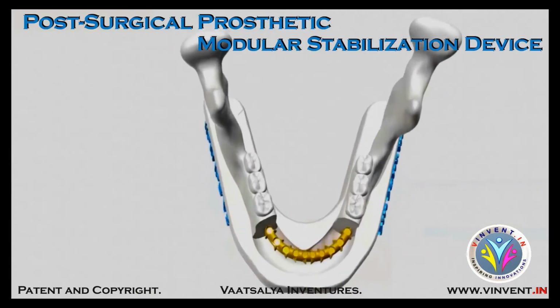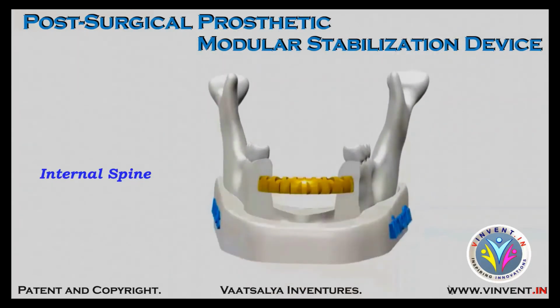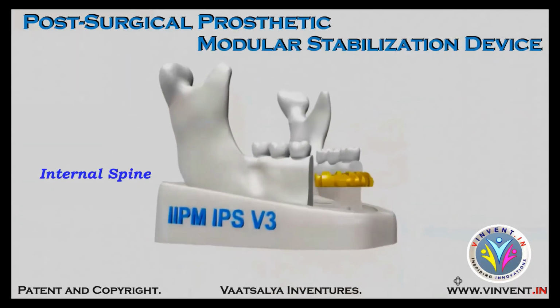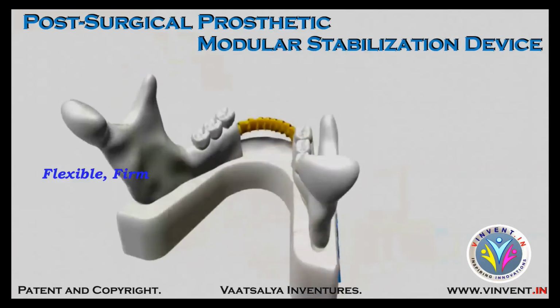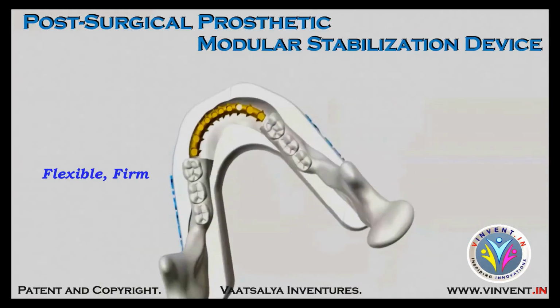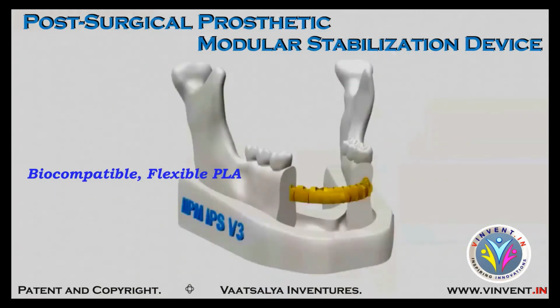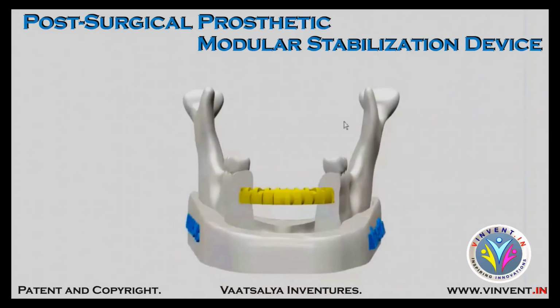Now let us talk about the components. The first component I would like to talk to you about is the internal spine. The yellow component which you see here, it is a flexible but firm U or V shaped component made of biocompatible flexible PLA material by direct 3D printing method. Let us come back to the individual features later.